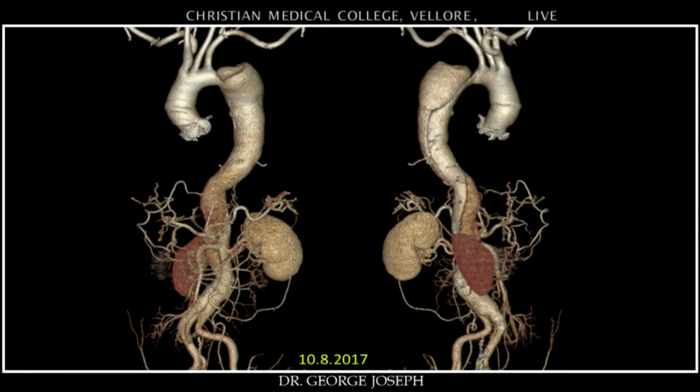So that's the 3D reconstruction of his aorta. You can see a type B dissection extending from the left subclavian onwards to the right common iliac. And the right kidney, you can see, is smaller than the left. It's opacifying less than the left. And this dissection starts right at the left subclavian. What you're seeing is the luminogram. So actually there is a thrombus-filled part of the dissection abutting onto the left subclavian. And you can see the three arch vessels are very close to each other. And you can also appreciate that the true lumen is really squashed in the image on the right by the false lumen. Next slide, please.